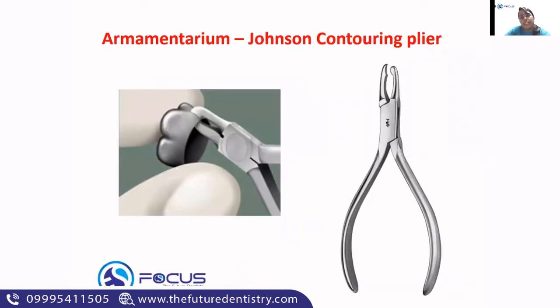Now, the next thing that you need to know is your Johnson's contouring plier. As the picture says, it has a concave end as well as a convex end. The main function of a Johnson's contouring plier is that when you adapt it onto the gingival surface, you can properly contour it in the shape of the tooth itself. This is particularly helpful in the case of a preformed band.